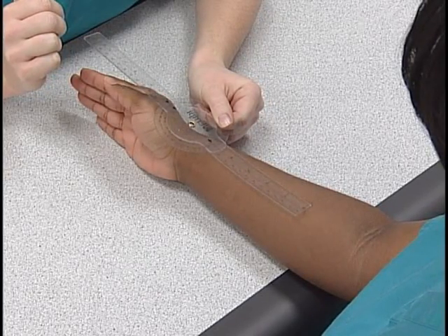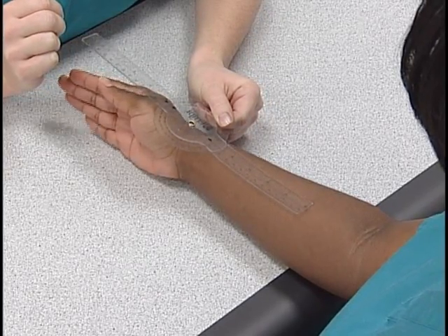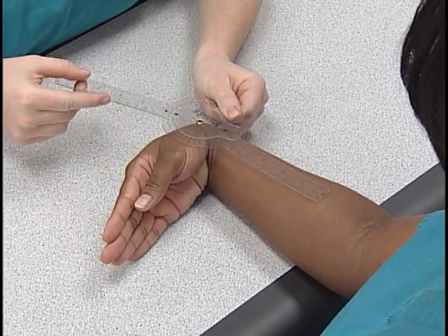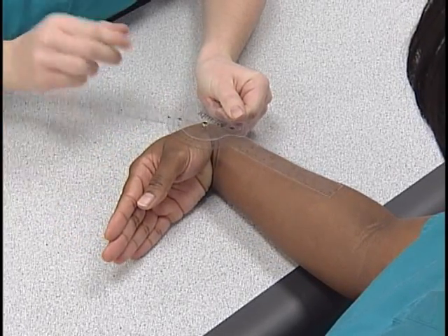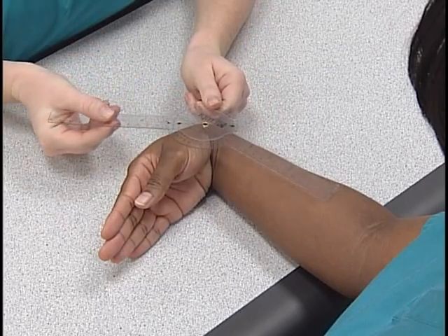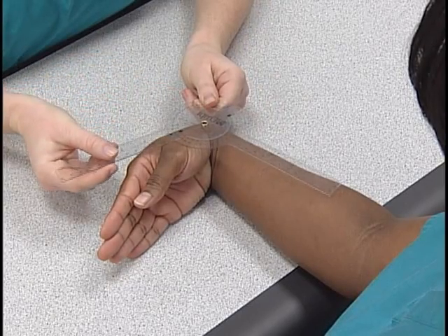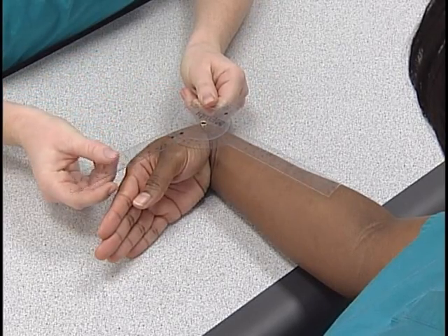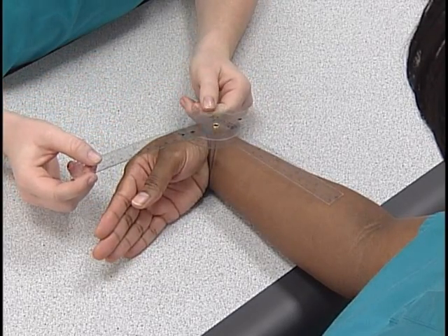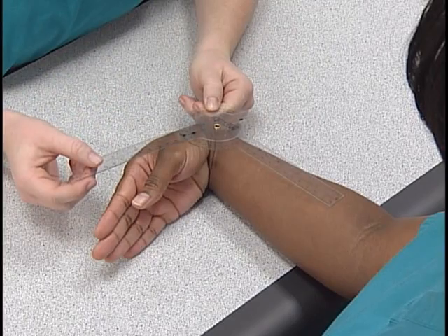The client's hand is flexed down so that the palm moves closer to the volar aspect of the forearm. The measurement begins at zero degrees and can range up to 80 degrees.